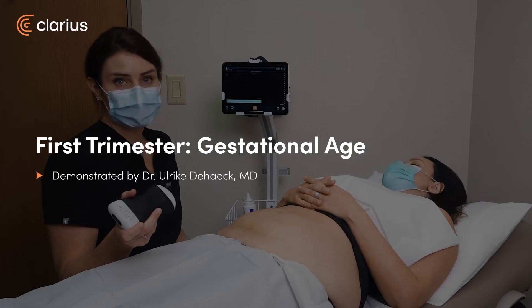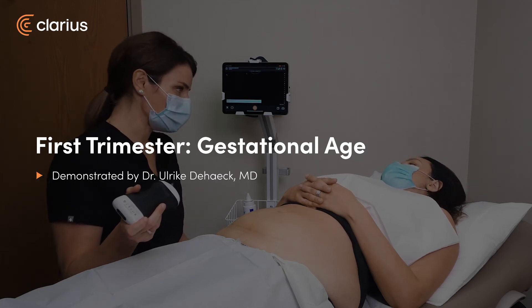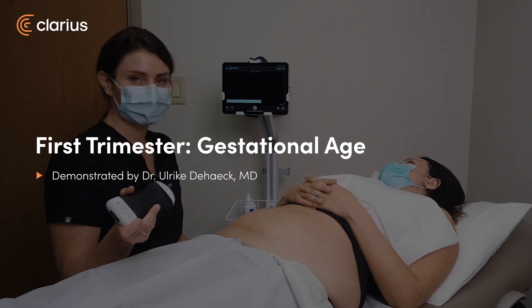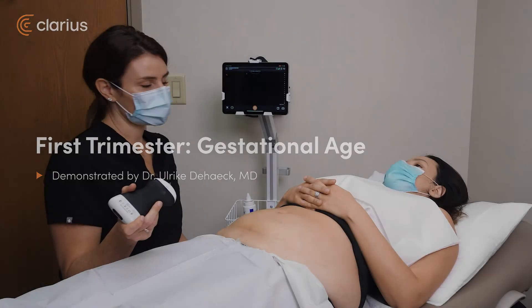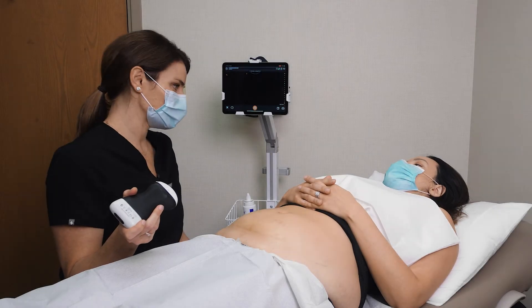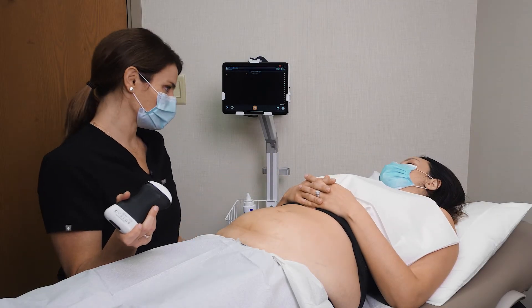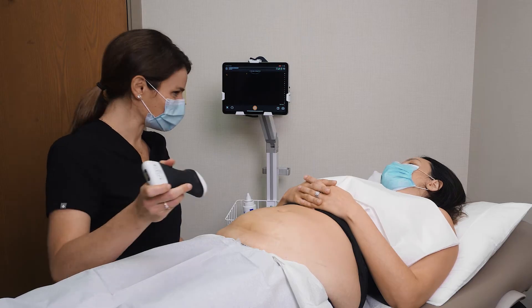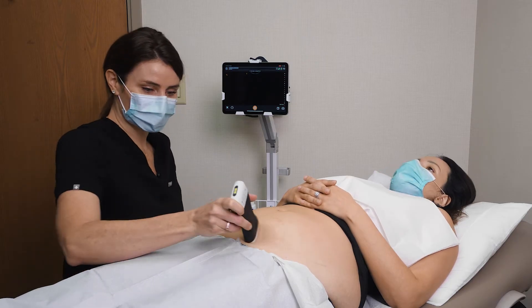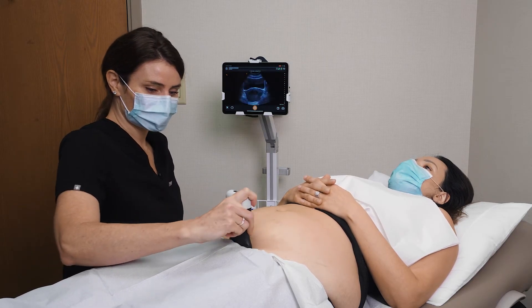We have our patient in her first trimester here today. We're going to scan and have a look at the gestational age and the fetal heart rate, and then I'm actually going to send you some of the images and videos afterwards, which is really neat, so you can have them as a keepsake.